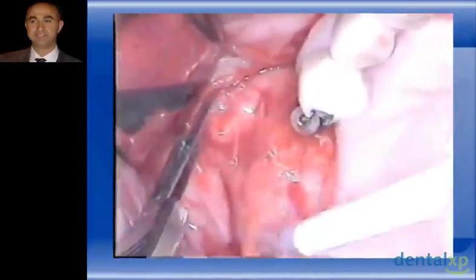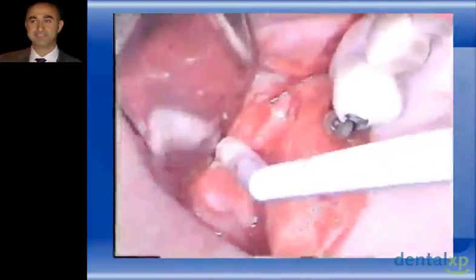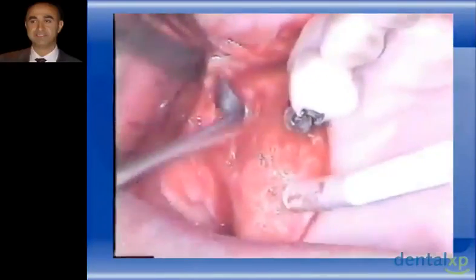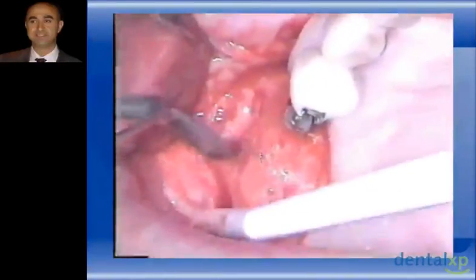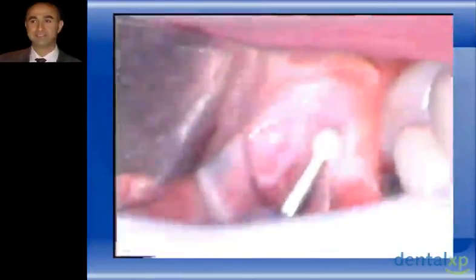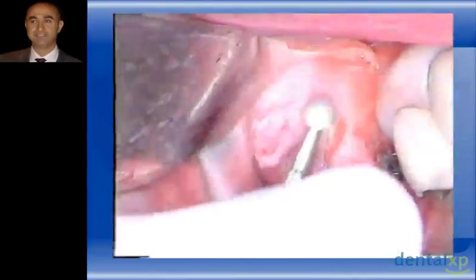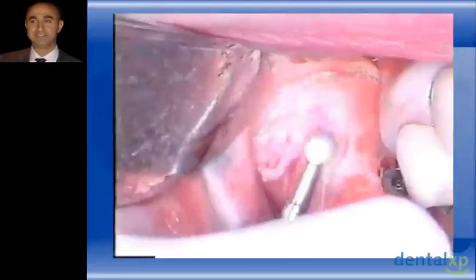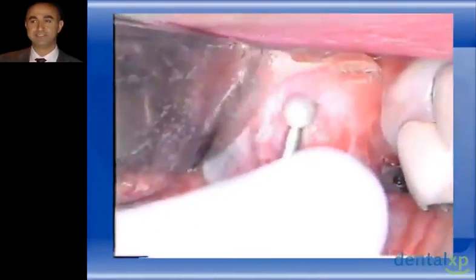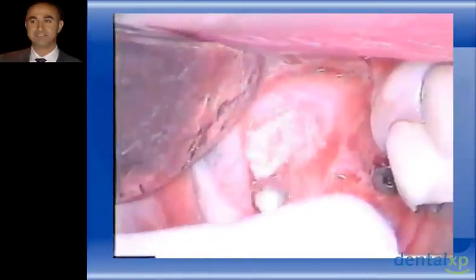The patient came back after 6 months, and this is after 6 months. You can see that one of the implants placed here was a closed sinus elevation at the beginning, which was stable and is now integrated. Now, re-entering the same surgical site that was done before, using the same old technique of the large round diamond burr to open what was open before, and attempting to re-elevate the newly regenerated membrane of the sinus again.